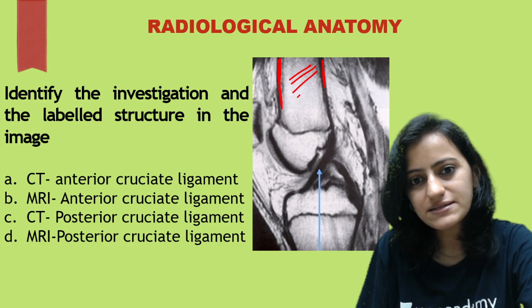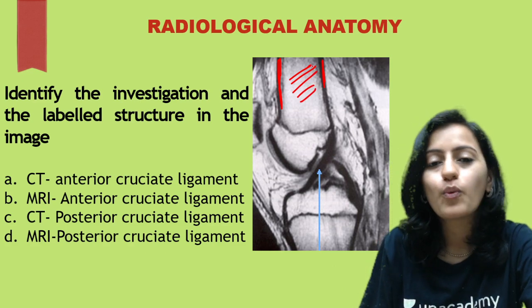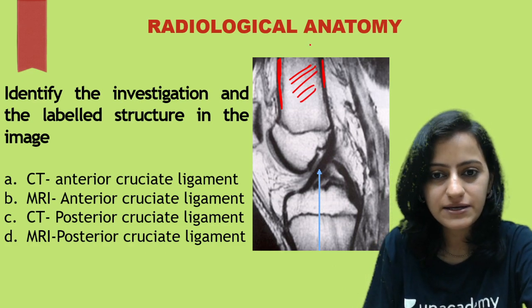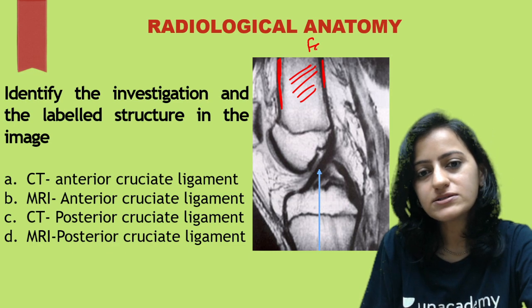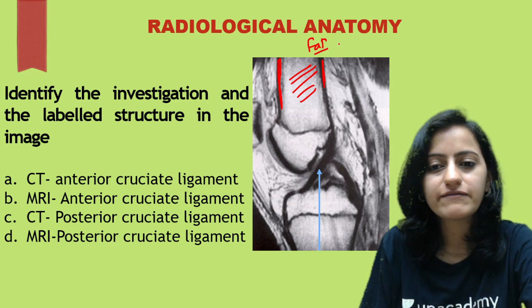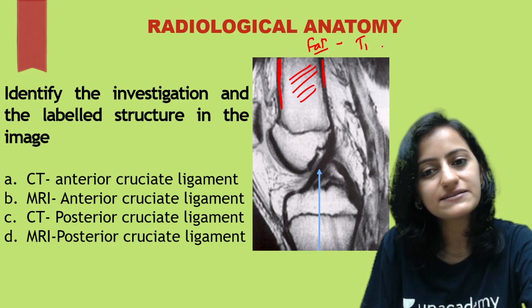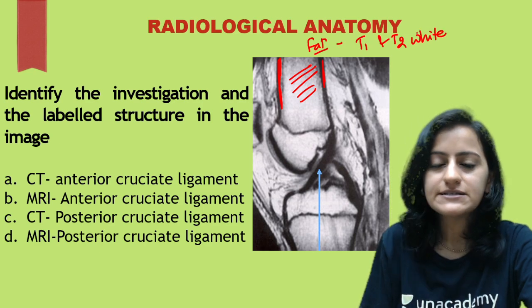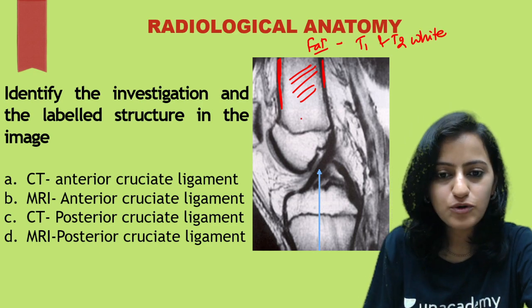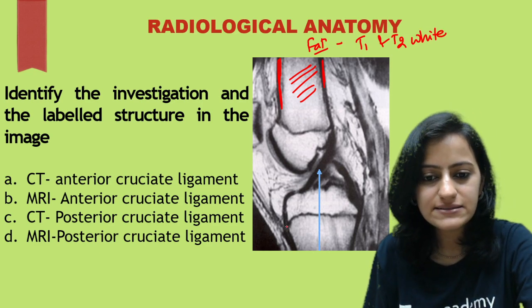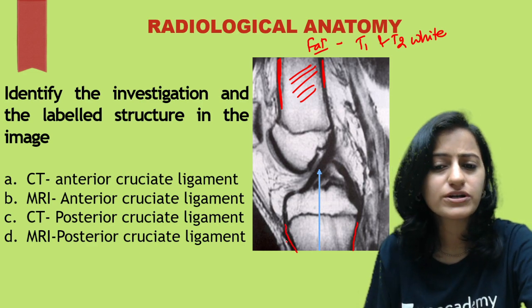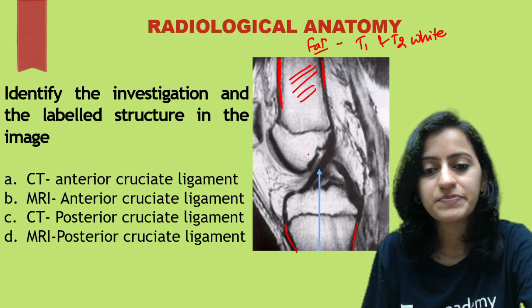The white area here is the bone marrow. Why is the bone marrow white on MRI? Because it is a fat-containing marrow, and fat is white on both T1 and T2. So this is the bone marrow, and the black line represents the bone cortex — confirming this is an MRI.